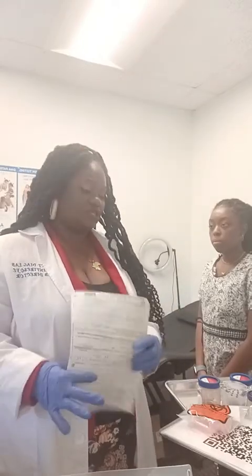All right, once that's done, I'm going to go ahead and give Isabel, the donor, a copy, the 5th copy, and I'm going to fax over the MRO copy to him or her, and I'm going to keep one for myself, and the last copy goes to the DER. You want to do that because you want to make sure you're paid for sure. And at this point, before I remove my glove, I'm going to discard the specimen. At that time, we both can go ahead and wash our hands.